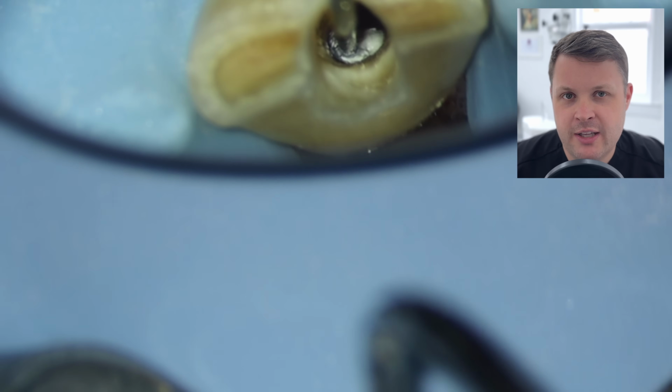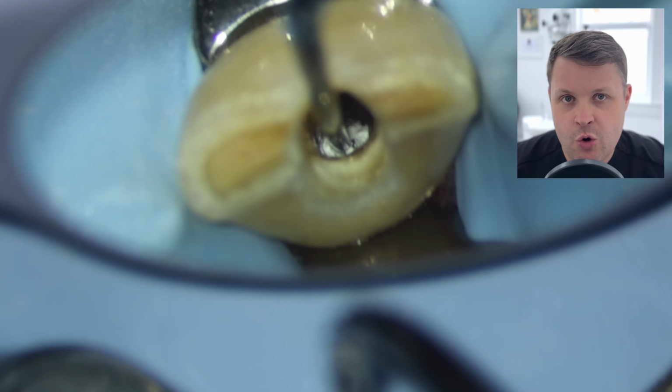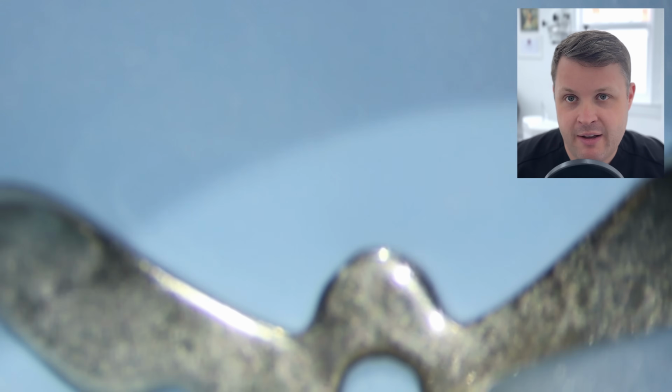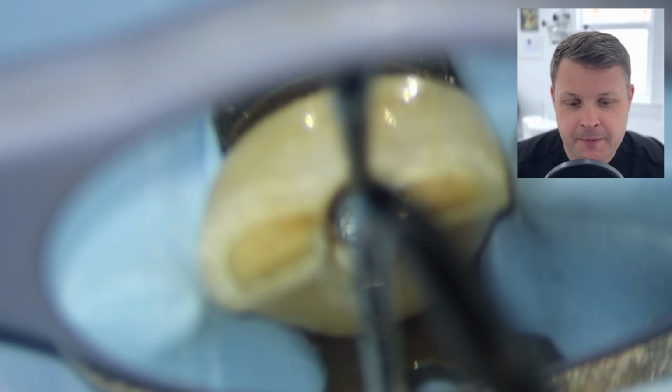And you want to make sure that you're pushing this down significantly, because what you don't want is any space in this perforation, because that's where obviously bacteria can proliferate. You also want to be careful you don't block the main canal with the bioceramic, because that can be a bit of a tough one to do.